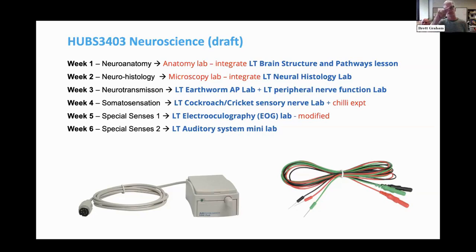And you can pick up this sort of sawtooth arrangement on your electrooculography trace, which is nice. But that sawtooth has a certain directionality to it because there's the long phase and then the short phase, right? Remembering that the sawtooth is going in one direction, fine. What happens is you'll see over time, after the second or even the third rotation, that sawtooth diminishes until it becomes 0. It's because what's happening is the fluid in the inner ears is catching up with the head.